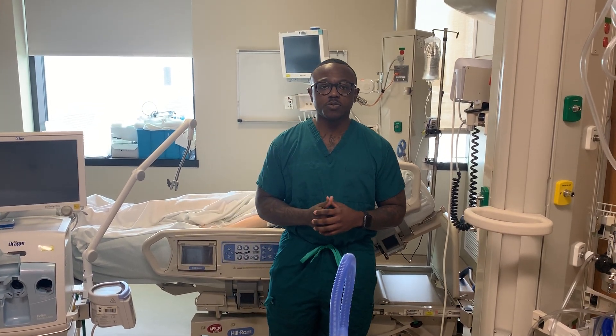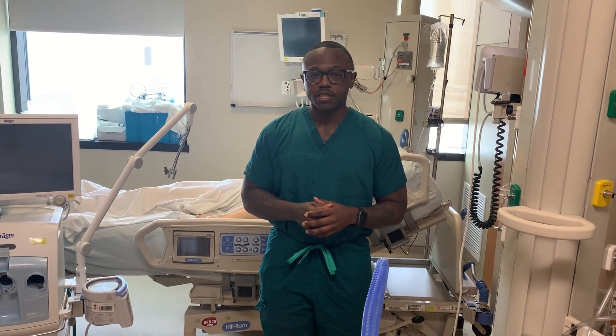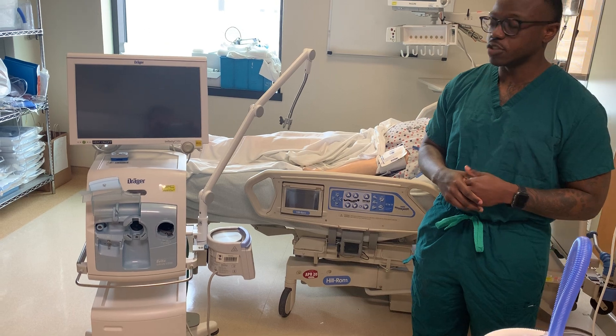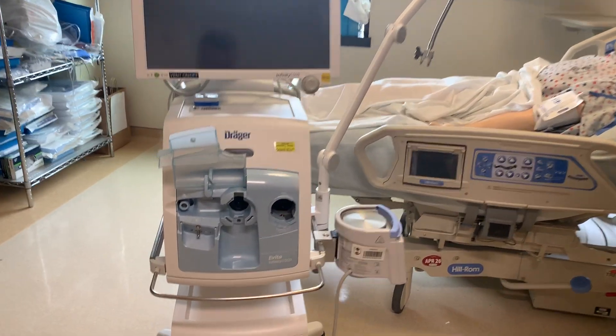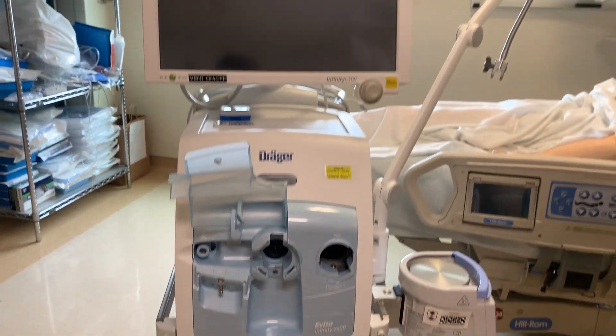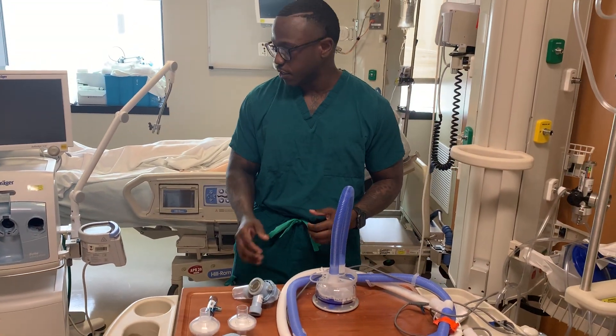Hi everyone, I'm Darius, a respiratory therapist here at Bethesda, Maryland. Today I'm going to be covering the basic setup of the V500 Draeger Mechanical Ventilator. I'm going to be explaining the external setup and some of the pieces that go into the ventilator.